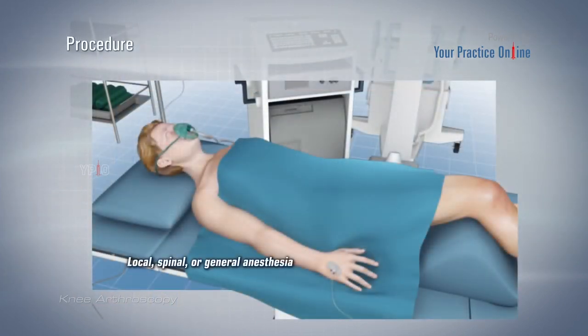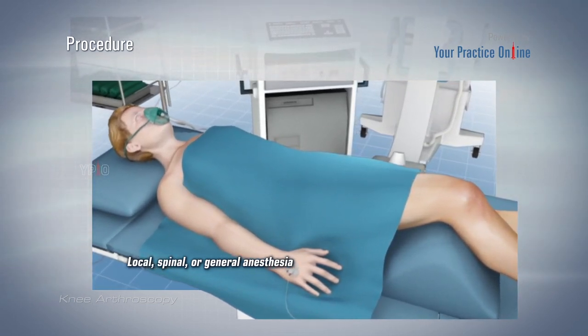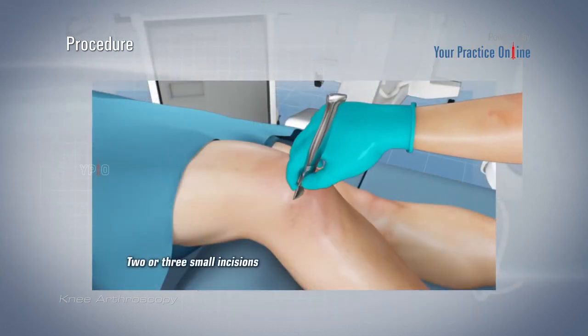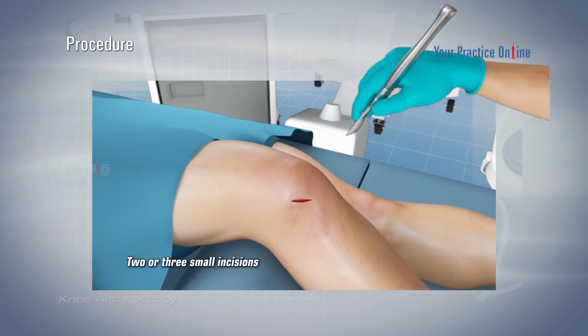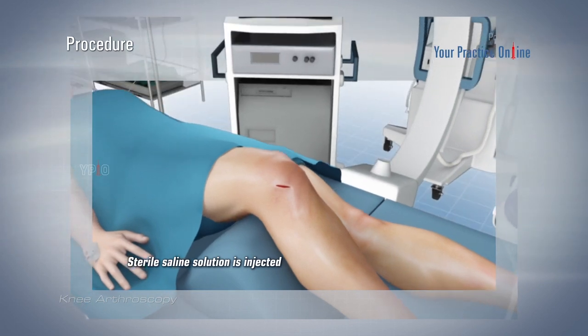Procedure. Knee arthroscopy is performed under local, spinal, or general anesthesia. Your anesthesiologist will decide the best method for you depending on your age and health condition. The surgeon makes 2 or 3 small incisions around the knee. Next, a sterile saline solution is injected into the knee to push apart the various internal structures. This provides a clear view and more room for the surgeon to work.